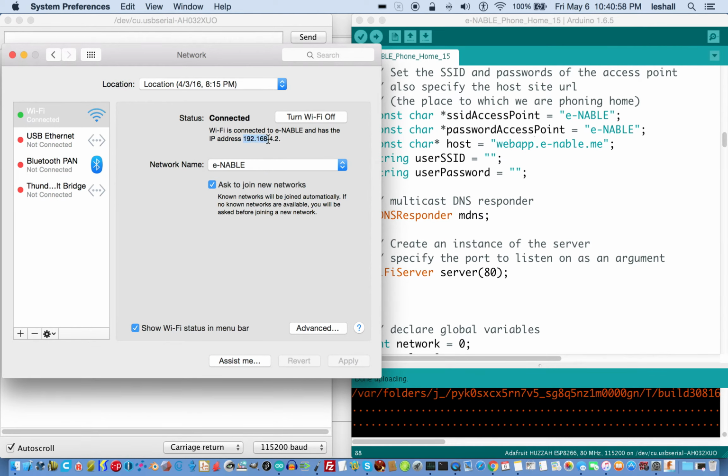And there in your network preferences, it'll show you the local IP address of the computer, which is 192.168.4.2. Well, if you see this, you got to realize that the last digit we want to change to a 1 because it's the access point and apparently it's got to be a 1. I don't know, I'm just winging it. You may know better as to why.